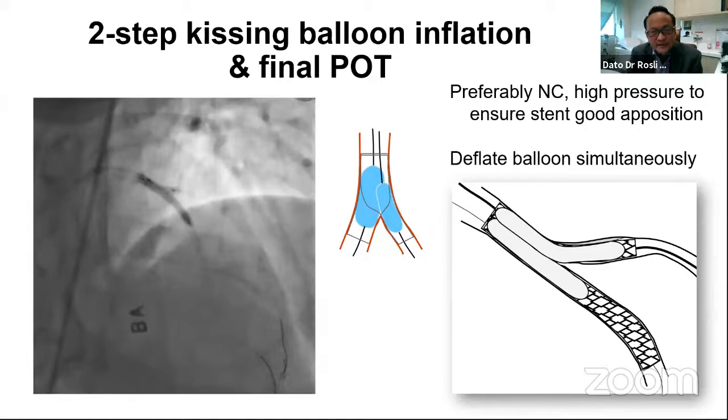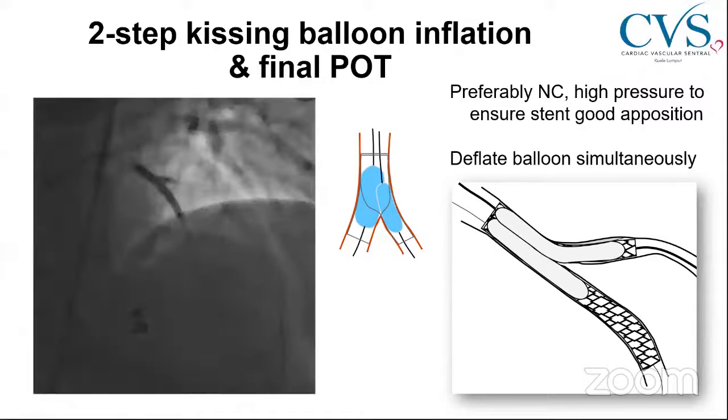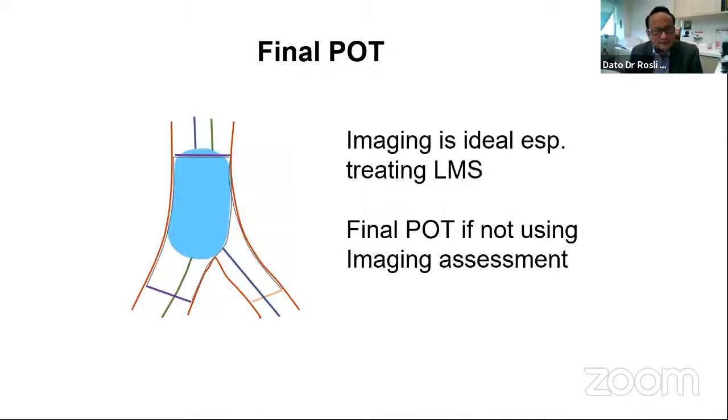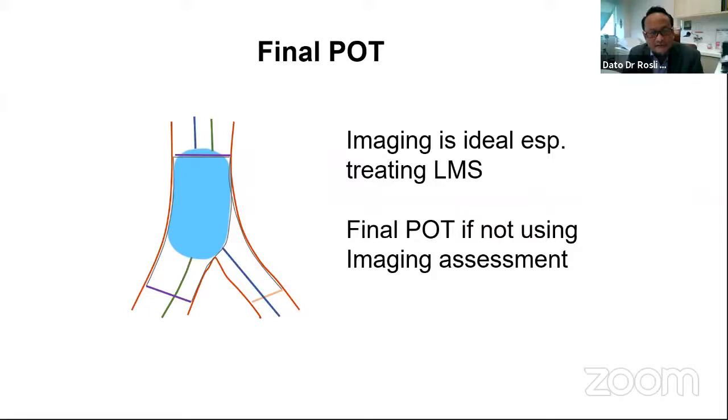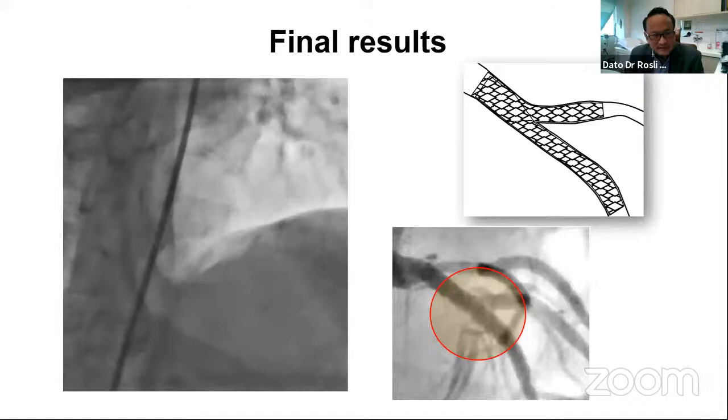Once you have done with kissing, then you should be thinking about a final POT if that is necessary. Remember always to try to deflate the balloons simultaneously at the same time, because sometimes if you deflate one after the other, you can have some distortion of the stent struts. So you want to avoid that from occurring. The final POT is preferable to be done, especially if you have an imaging, then that would be good. But if you are not going to have an imaging assessment, then the final POT is quite crucial in a sense. And this is the final result that was shown. So a pleasing result in the end for the LAD diagonal.